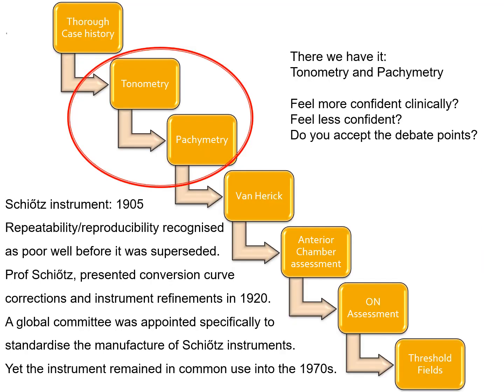So there you have it. An absolutely not black and white review of tonometry and pachymetry. You know, it's much easier clinically if we just believe that GAT's the best. It makes our lives far easier. But I don't believe the debate is closed on that. I don't believe GAT is the gold standard. It's certainly the reference standard, but it's certainly not the gold standard.